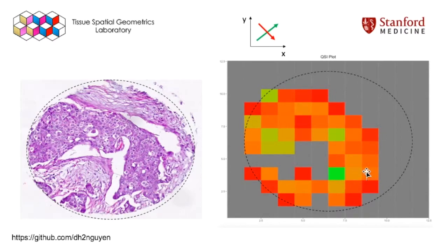And if you look at this inner edge, there are some patches where a lot of slopes are pointing upward. In between are oranges, where there's a transition zone between the upward and downward pointing nuclei. In this case, we only mark the epithelial nuclei, not the stromal nuclei here in this fibrous region, which is this blank gray area.